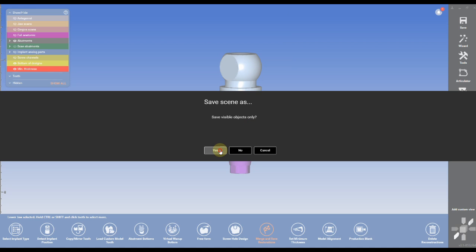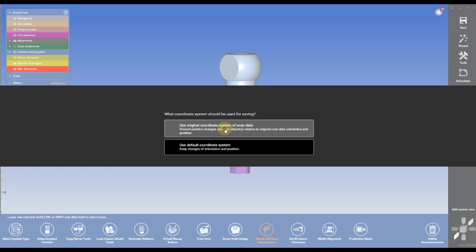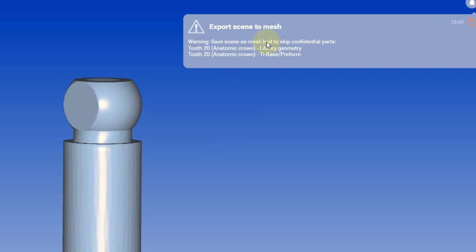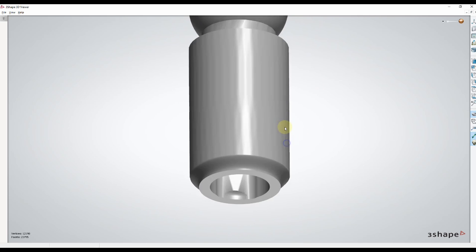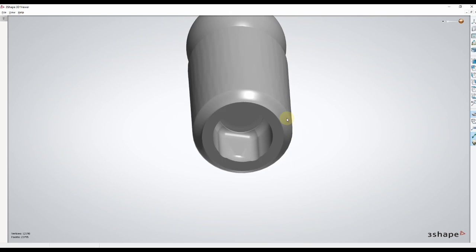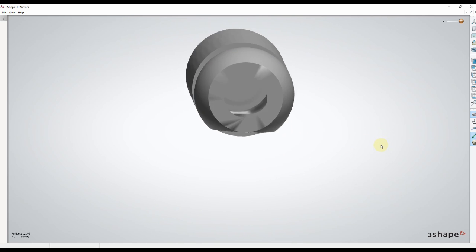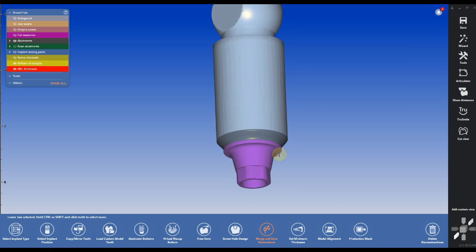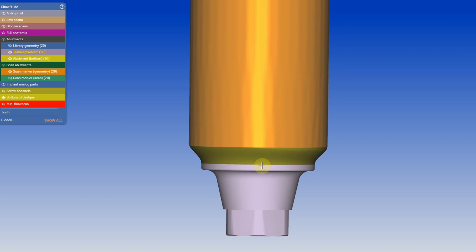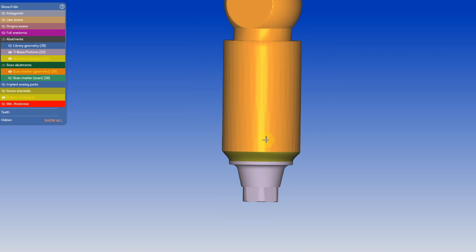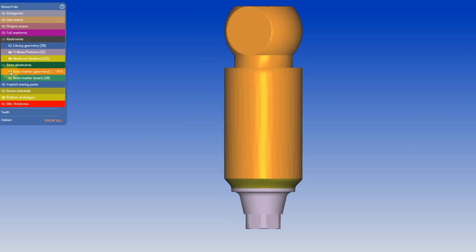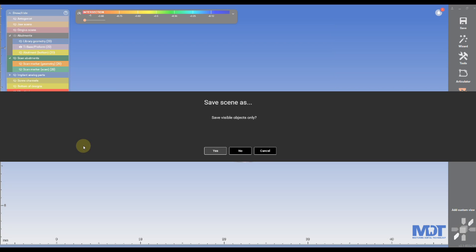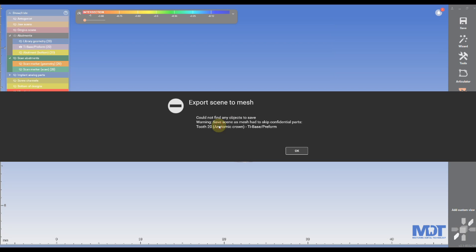If we output the export scene, you can see only certain parts are getting output, and the tie base is not inside the scan body that we export. So what we need to do is find a way to export the tie base by itself.